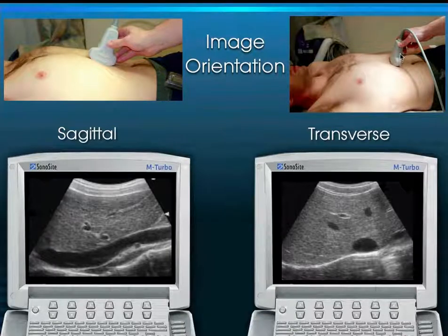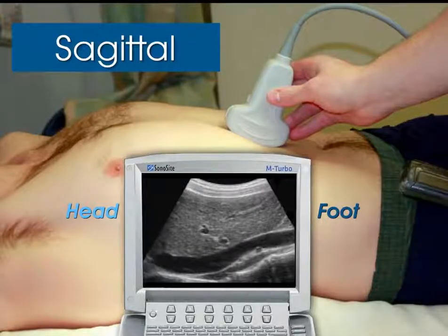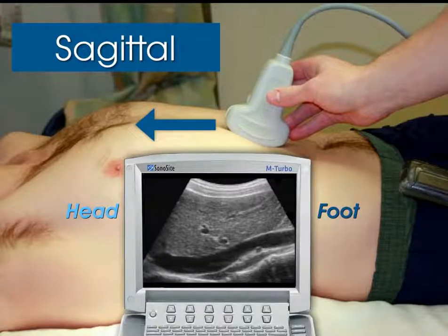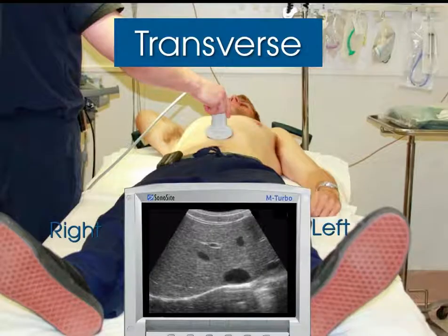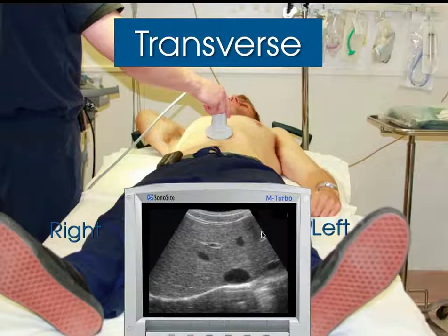In the transverse view, the indicator is towards the patient's right. The same IVC seen in short axis shows patient's right on the left of the screen and patient's left on the right. To reiterate: sagittal means longitudinal as approached from the anterior portion of the body — the long axis approached anteriorly. Transverse is as if standing below the patient's feet, similar to reading an axial CT scan, with patient's right on the left side of the screen.